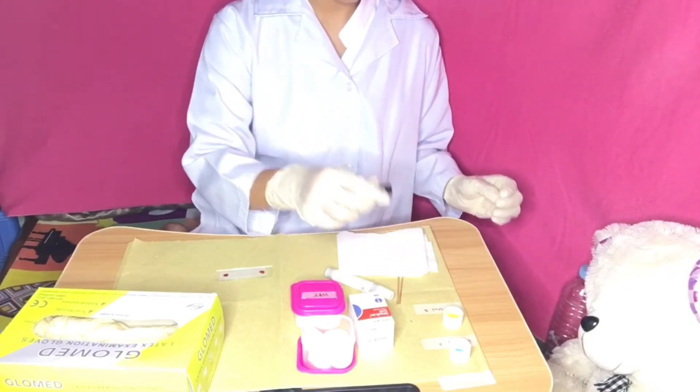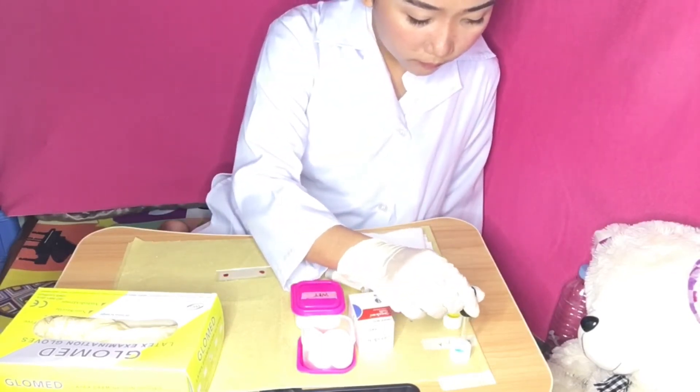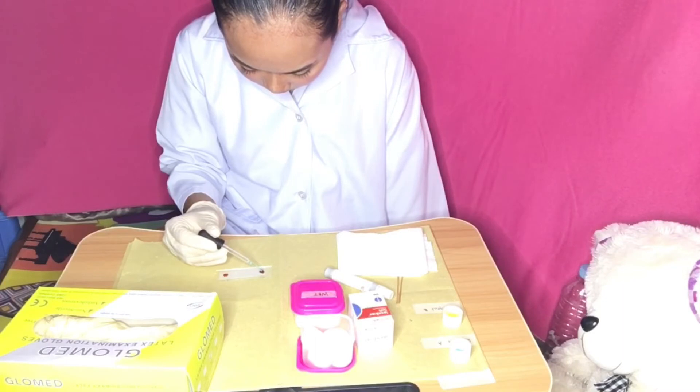Add a drop of antisera A, which is color blue, over the first blood on one side of the slide, and antisera B, which is color yellow, on the other side of the slide where the second drop of blood is.